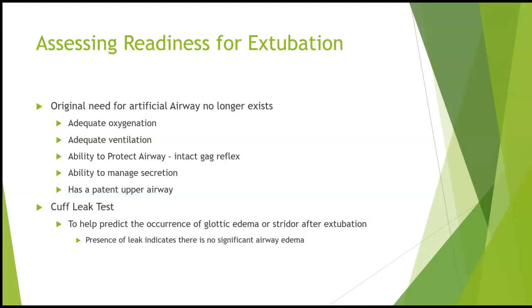So to help predict the risks of developing glottic edema or stridor after extubation, we perform something called a cuff leak test. This is where we deflate the cuff on purpose, and we're looking for the sounds of airflow around that cuff.